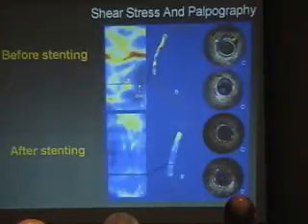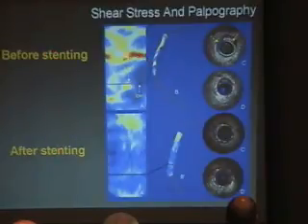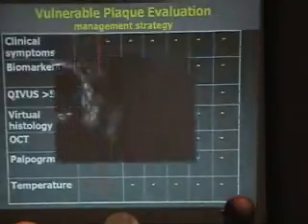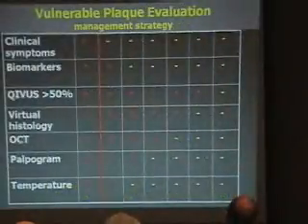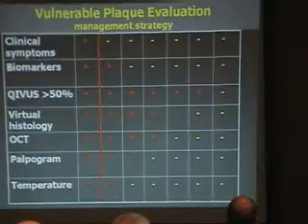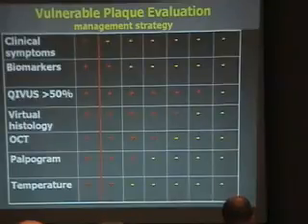And finally, if you repeat the shear stress analysis before stenting and after stenting, as you could see, all these regions, these alternations of high shear stress and low shear stress, have disappeared because you have again scaffolded the vessel. I have no conclusion tonight, but it's clear that we are making progress in the assessment of what we believe to be an unstable plaque, a vulnerable plaque, something which is on the verge of rupturing. And we try to develop some kind of algorithm of treatment once you are so far in the game that you are confronted with the compelling evidence of all these technologies. Thank you.